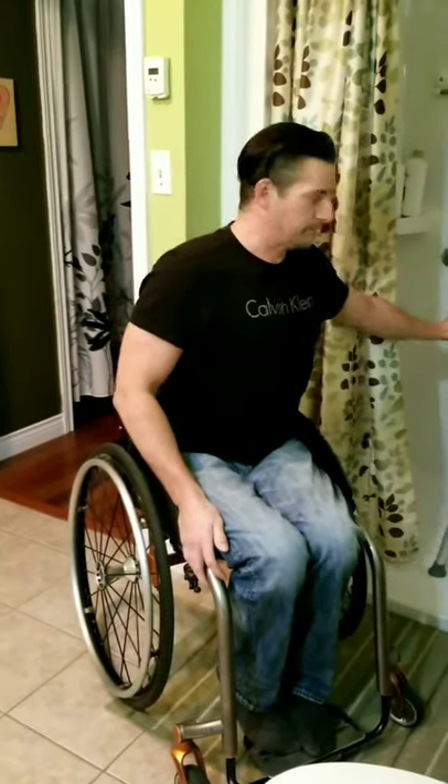Hey everybody, welcome to Paralife TV. I'm going to do a quick video today just to show you how I transfer from my wheelchair to my bath bench.